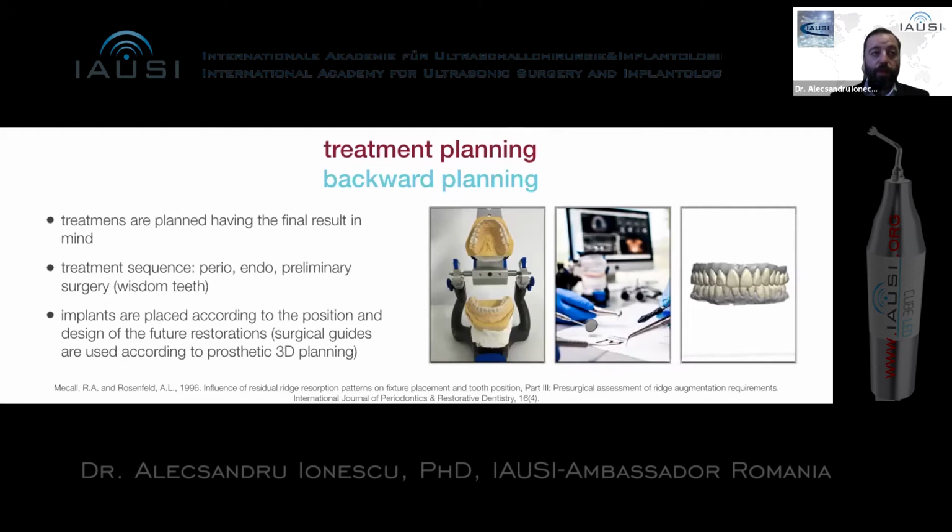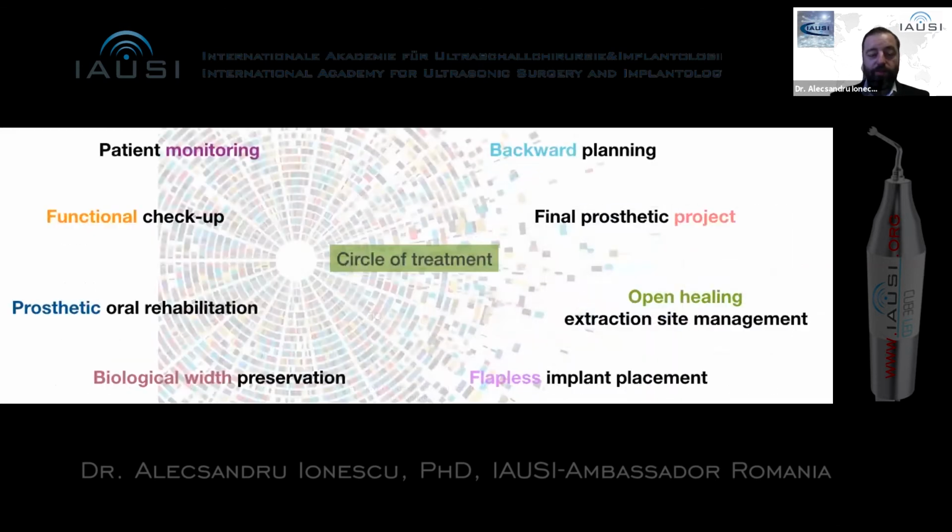When we were using the same concept but in an analog way, we observed that we had sometimes some, let's say, inadequate situations, like a few percents of a millimeter position, different position or things like that. But since we started with digital, we are improving to the, let's say, maximum this strategy. So this is our circle of treatment.